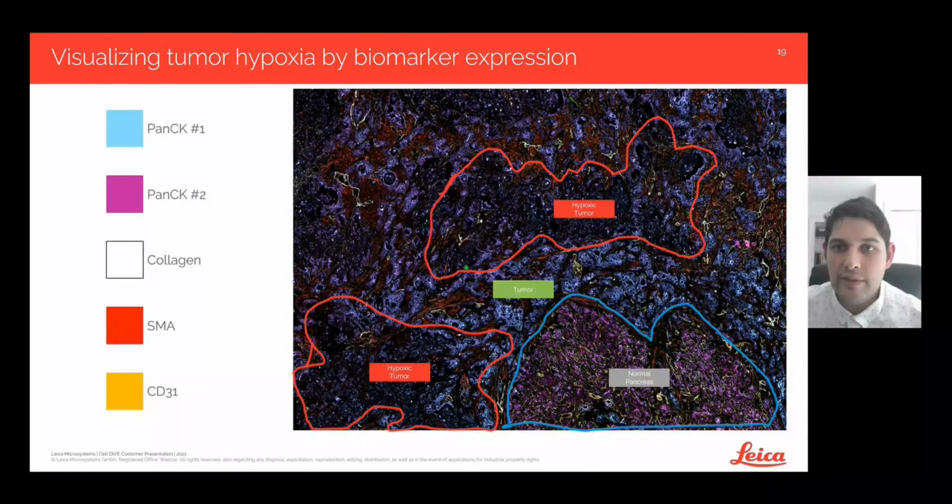Often hypoxia-adapted tumor cells are more aggressive. Here, using a small subset of biomarkers, just 5: 2 tumor, 2 vessel, 1 stroma, hypoxic regions of the tumor can be effectively classified compared to normoxic tumor. 5 biomarkers exceed the conventional methods for analysis on the same area of a slide, and it really only scratches the surface of information needed to understand aggressive tumor cells in the microenvironment. So clearly more biomarkers are needed to characterize the cell heterogeneity in the tumor microenvironment.